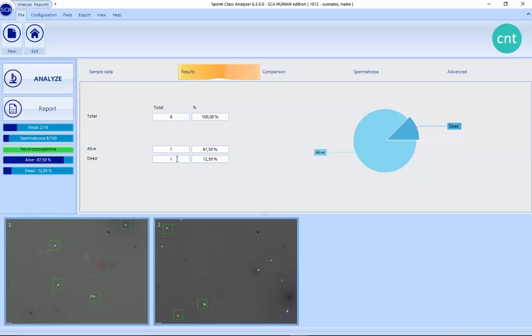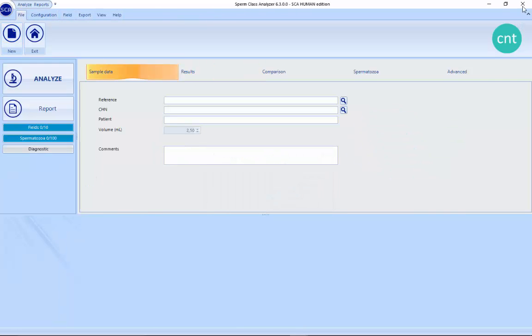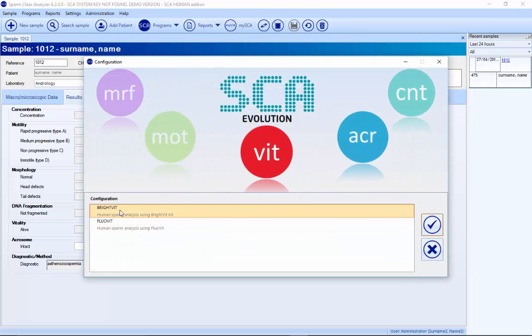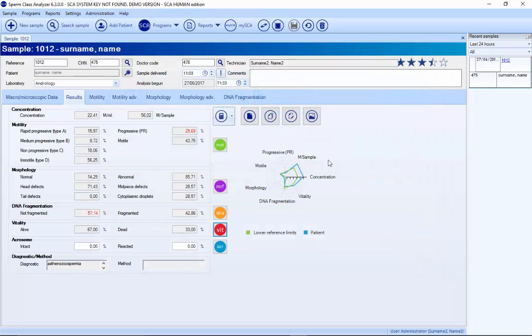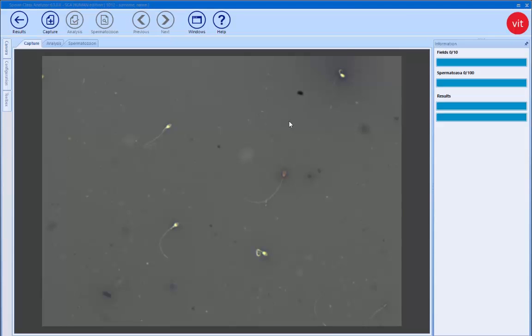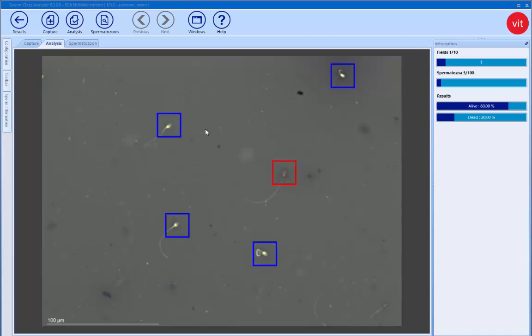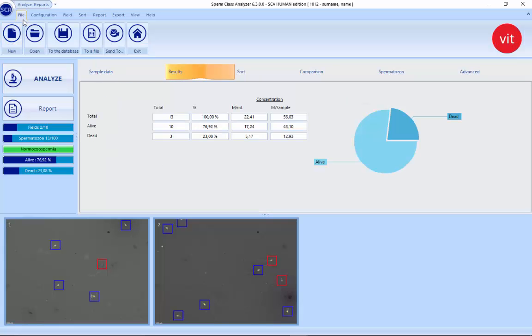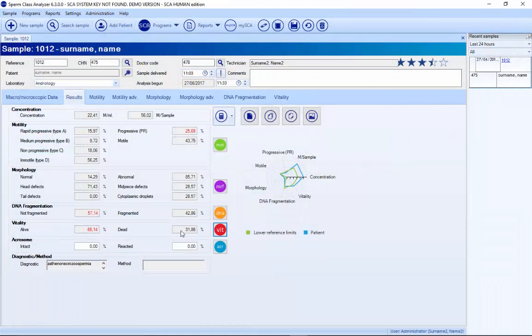At the end you will receive the percentage of dead and alive. But all this is also possible to do automatically. If we go to vitality automatic, we can do it in bright field or in fluorescence. If we select the BrightVit kit, it's fully automatic — you just press analyze, and the system detects each sperm as alive or dead. You capture different fields, and at the end you have the percentage alive and dead, which is put automatically in the database.